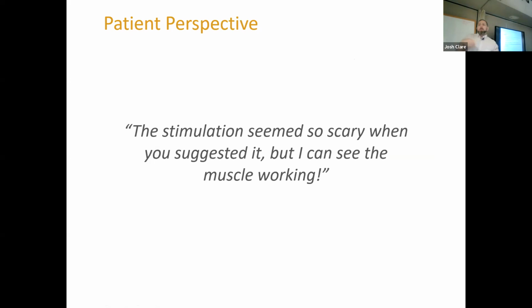So the next thing we're going to talk about is using our electrical therapies for muscle contraction. That's now the goal. What's the other E-stim that we've already talked about where our goal was muscle contraction? TENS, but which setting? The opiate liberation. For that one, we were hoping for a twitch type of contraction. Now we want a full-blown tetanic contraction, for either muscle facilitation or strengthening.